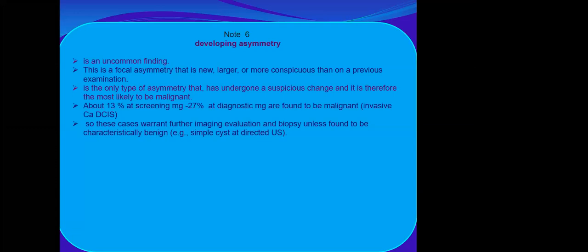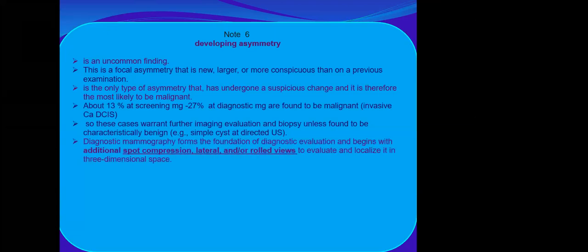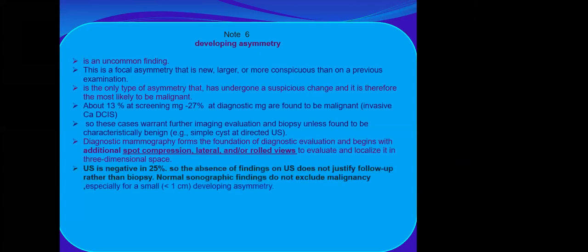So these cases warrant further imaging evaluation and biopsy unless found to be characteristically benign, like a simple cyst at ultrasound. Diagnostic mammography forms the foundation of diagnostic evaluation and begins with additional spot compression, lateral and rolled views as we described, and ultrasound is negative in 25% and should not exclude biopsy.